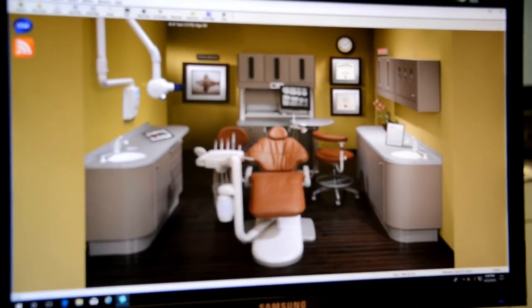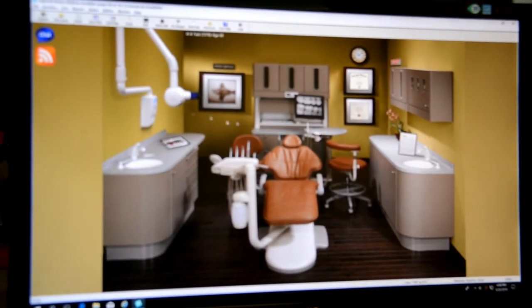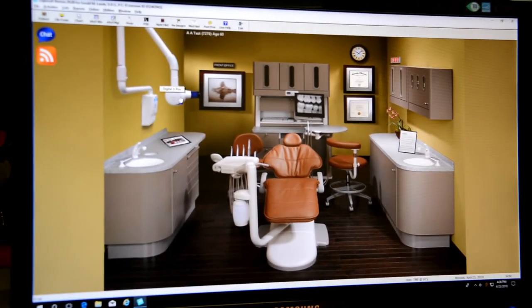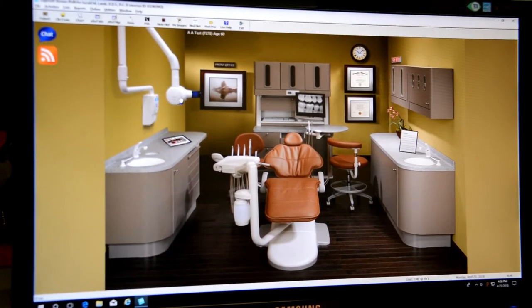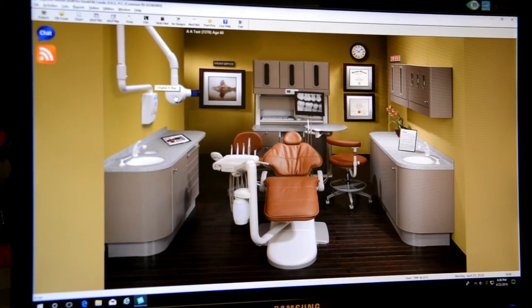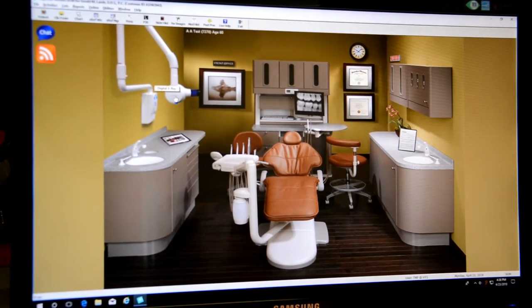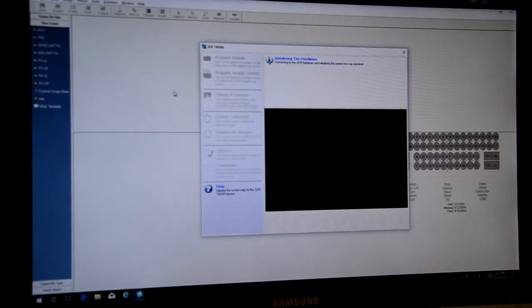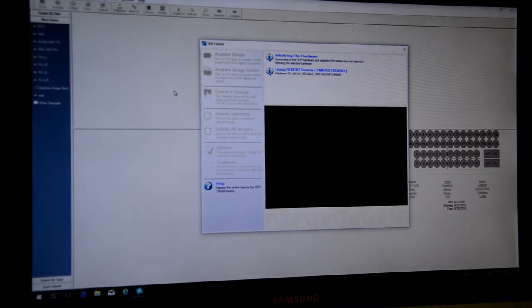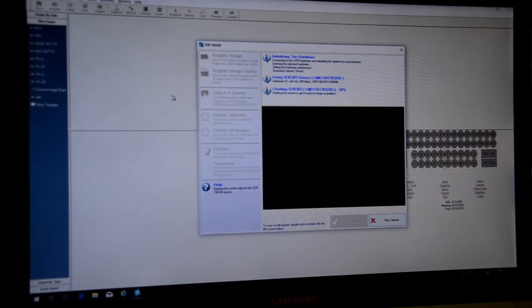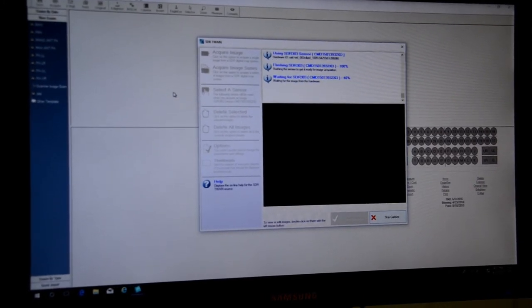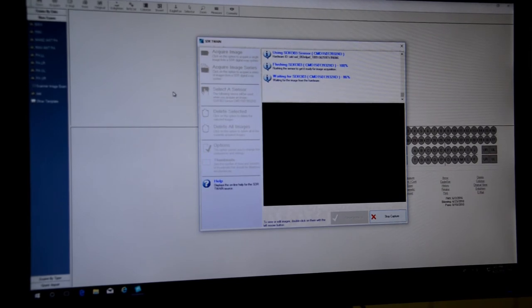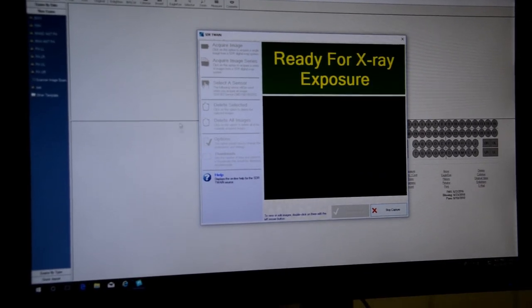So if I want to go from taking it and immediately just to sensor ready and taking a PA. If I click the tube head over here to the right. Go ahead and click that. It's going to go ahead and initialize the sensor. Have it ready to go. It's armed here. Once it turns green and we're ready for our exposure.